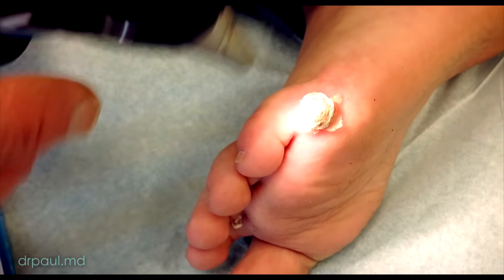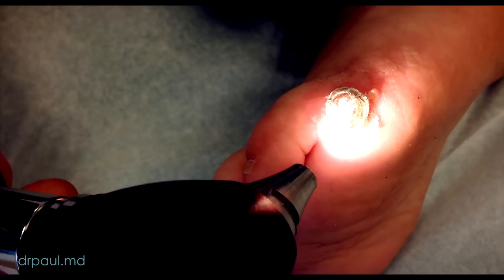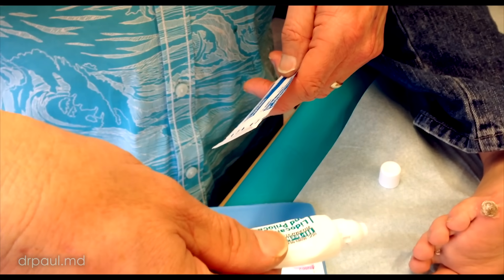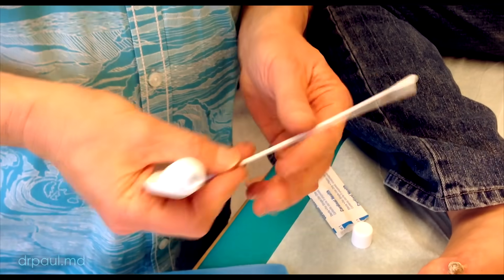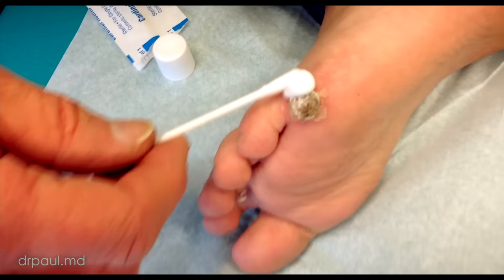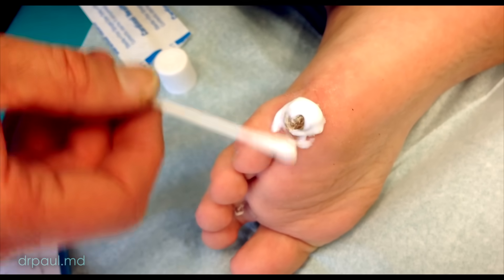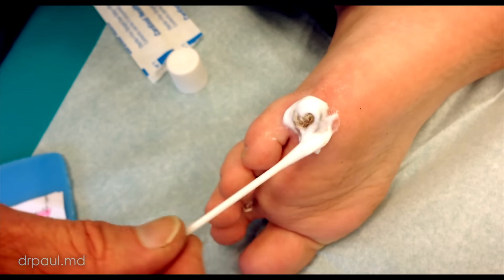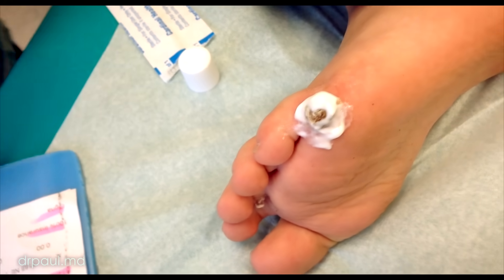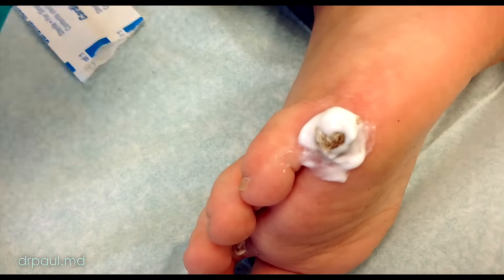It's about a half an inch wide, raised two or three millimeters. What we're going to do is put some numbing cream on that so that hopefully it won't hurt so bad. And then we're going to freeze it. This here is lidocaine and prilocaine — the brand name is Emla, this is the generic. Because of the nature of that wart being so big, we got to get it around, because we're going to freeze a little bit of your normal skin. We'll just leave that alone for 15 to 20 minutes and then we're going to freeze it.